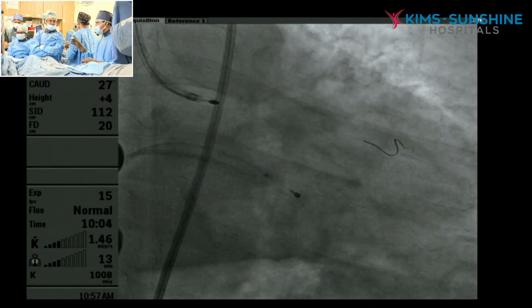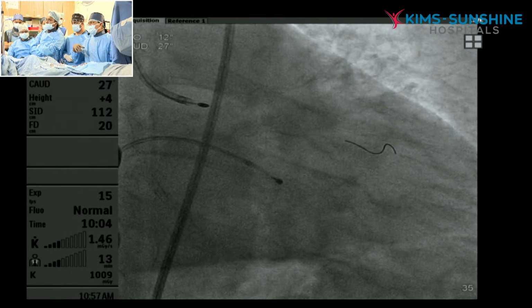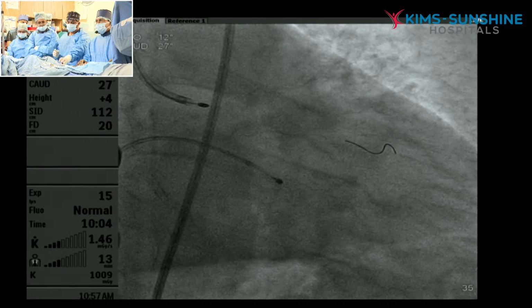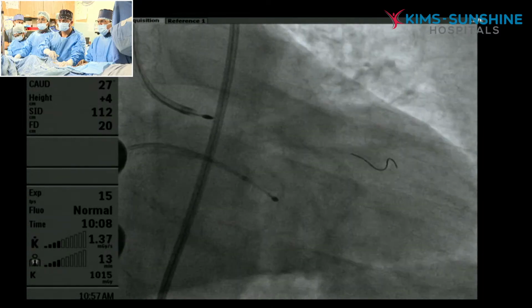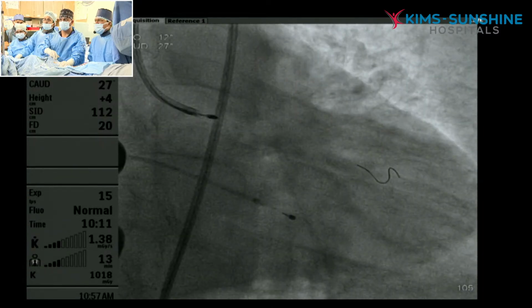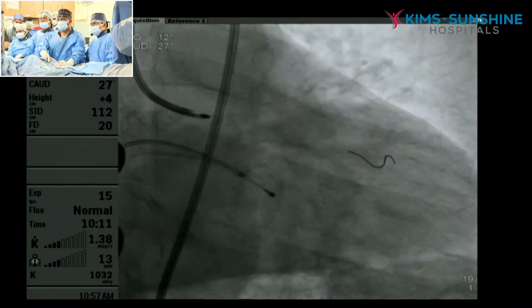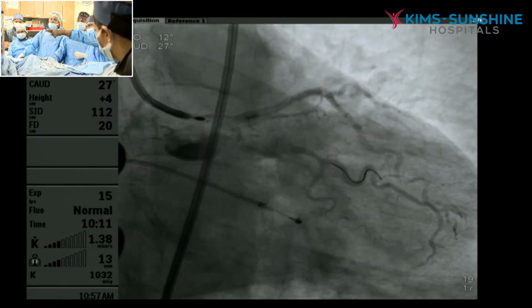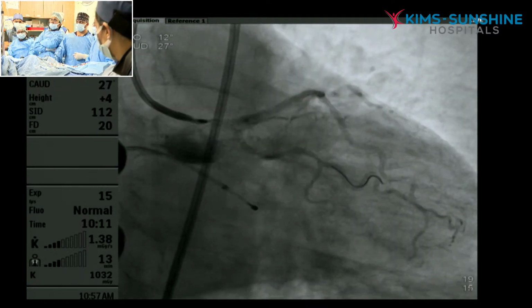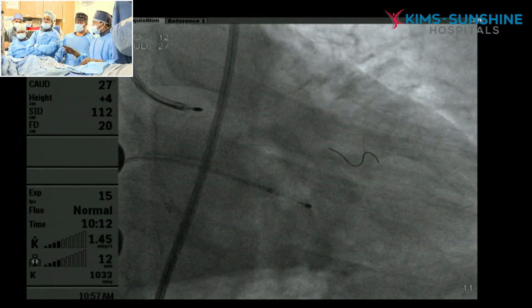If needed, and I think the rota bar volume, check the value because the rota bar is occupying the left main. Will give a small injection. If needed, I can put it into the catheter also. Ready, Amiru? Now flowing well. Good injection. See, nicely flowing. Actually, that is also opened well. I think no need of doing further. Compared to earlier, it's already opened. We can come out. Volume is good, right? Over. Yes sir, over. Can go ahead.